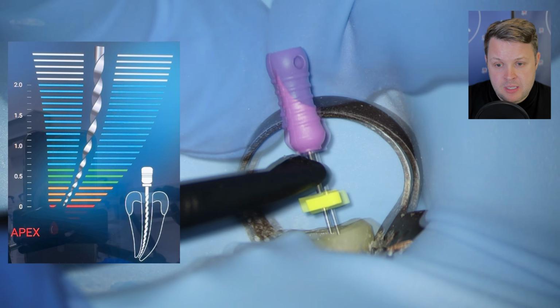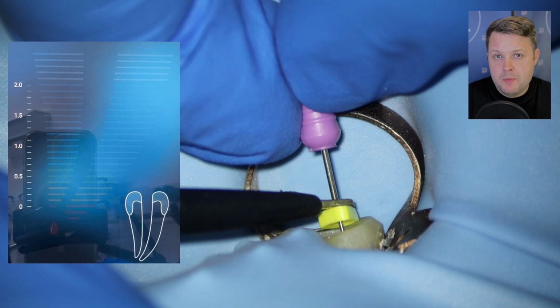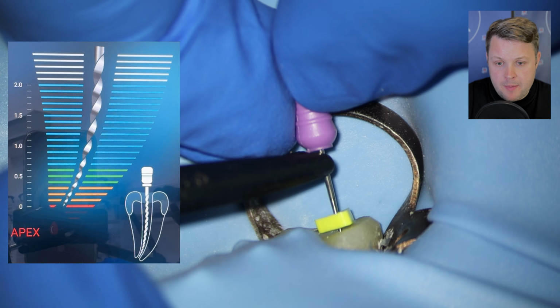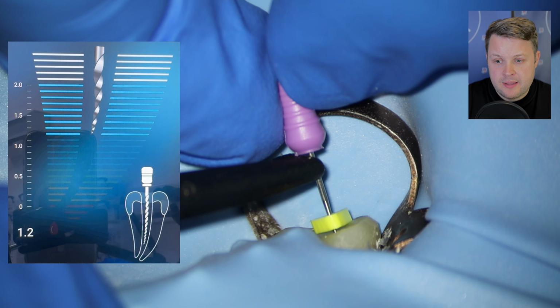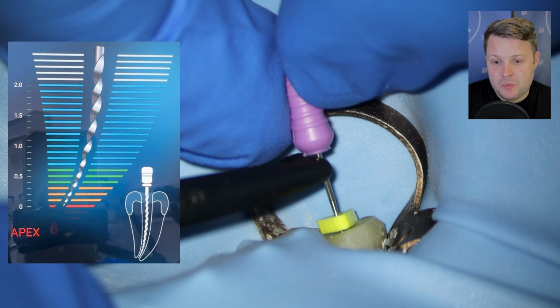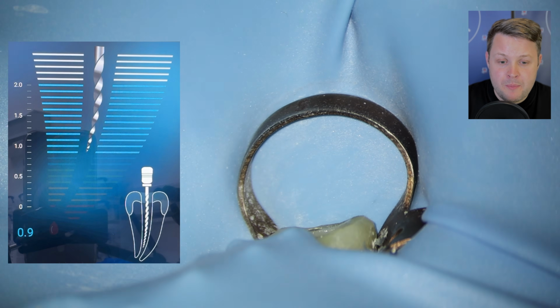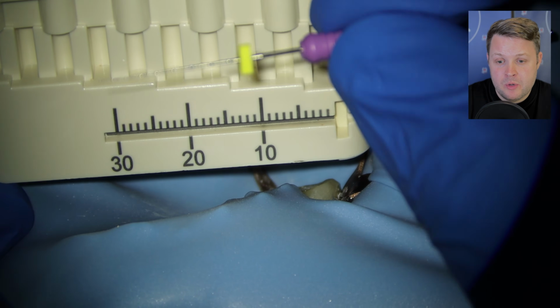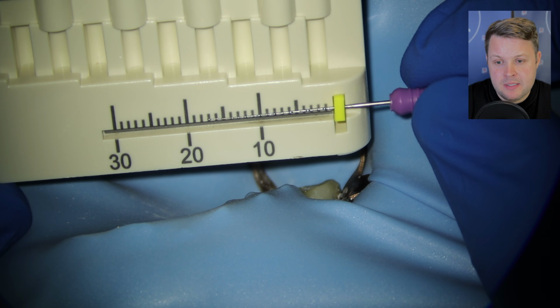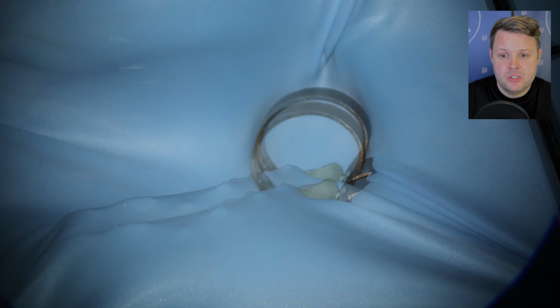We're going to push the hand file through, back it up. And then once we back it up, we're going to adjust the stopper and just check that we're still at 0. Because sometimes when you move the stopper and then check 0 again, you've moved the hand file slightly. And when we pull the hand file out, we can see the working length is 17.5 millimeters. A bit shorter than the other canal, but that might be because of the cusps.